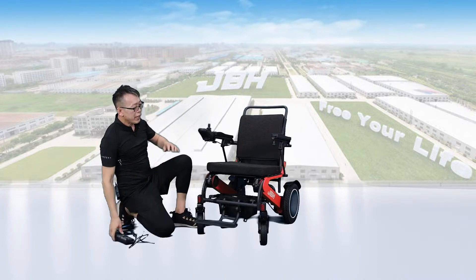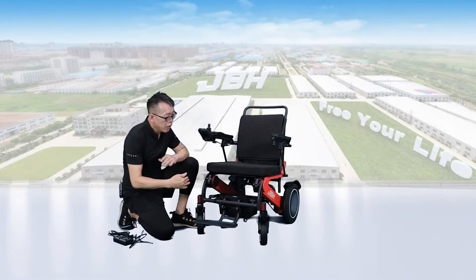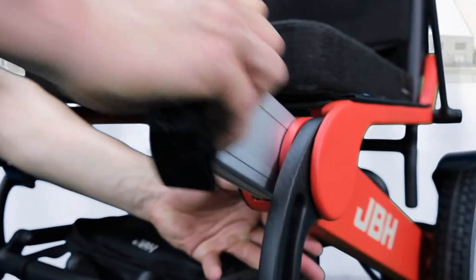The second way is to charge from the battery directly. This is an on-board charging battery. On this model, the battery is on both sides of the frame. You need to press here and then slide out the battery.